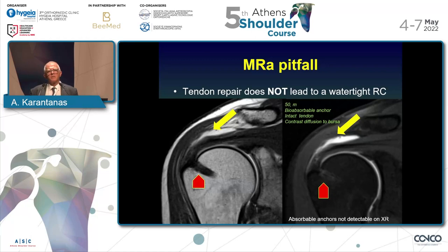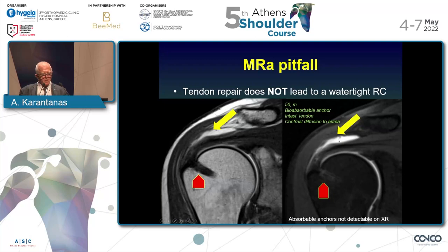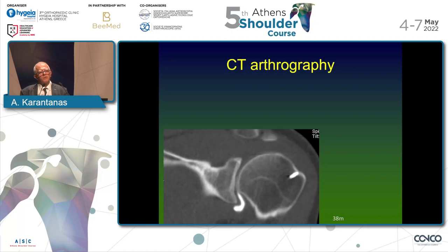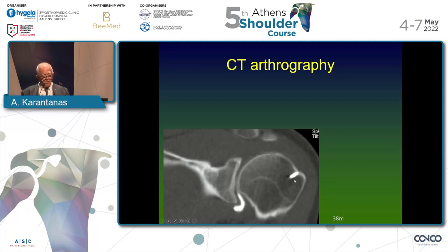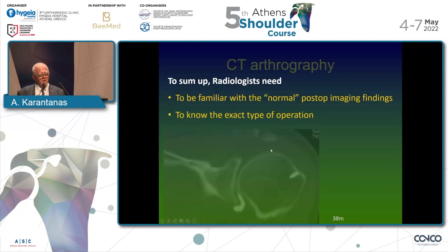Regarding MR arthrography, we perform arthrograms particularly in elite athletes who have undergone rotator cuff repair. You can see contrast entering the subacromial bursa, so tendon repair does not mean we have a watertight rotator cuff. CT arthrography may be used in patients who cannot undergo MRI due to claustrophobia, other contraindications, or because metallic components produce artifacts. The metallic anchor does not degrade image quality, and we see iodine in the axillary recess not escaping into the rotator cuff — a very good result.